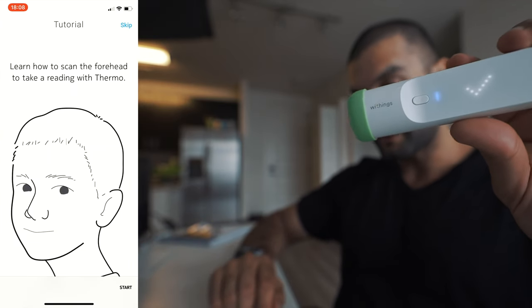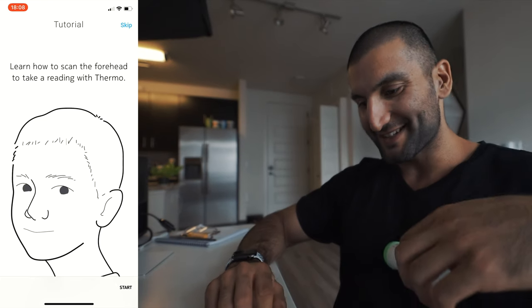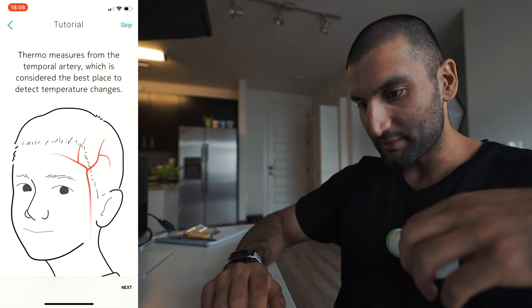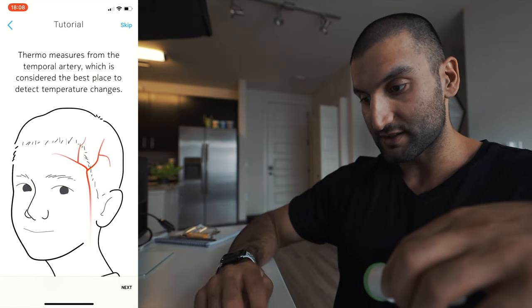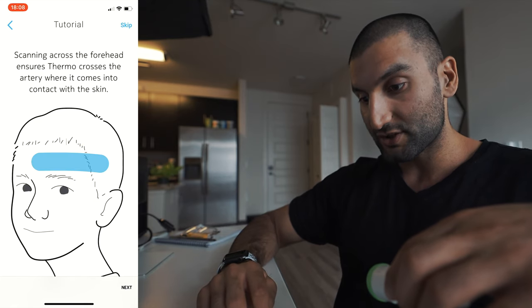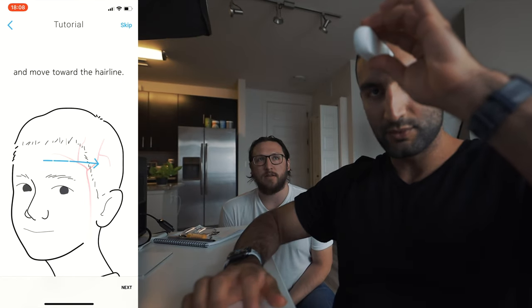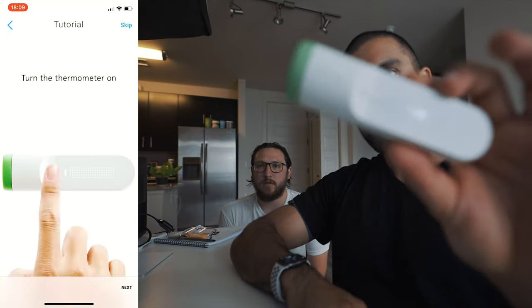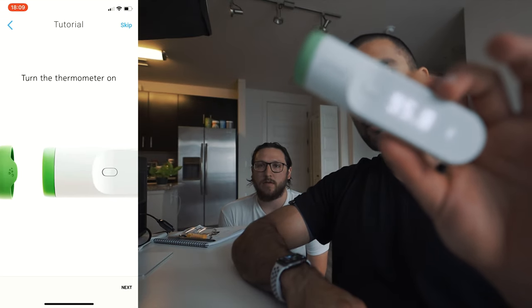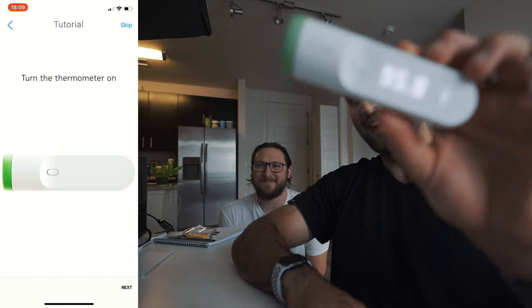Learn how to scan your forehead to take a reading with Thermo. Thermo measures from the temporal artery, which is considered the best place to detect temperature changes. Scanning across the forehead ensures it comes in contact with your skin. Move towards your hair — you can be a half inch away. Take the cap off. The thermometer is booting up. It currently runs Windows 7, so it might take some time.